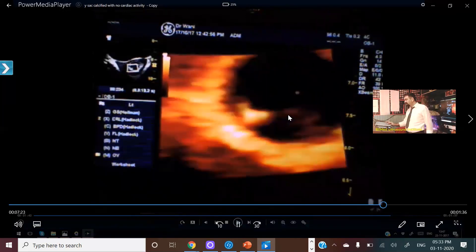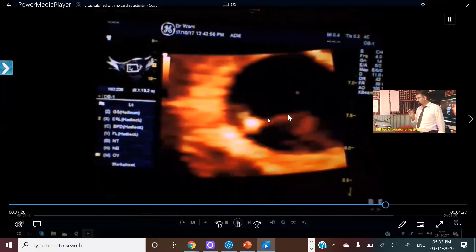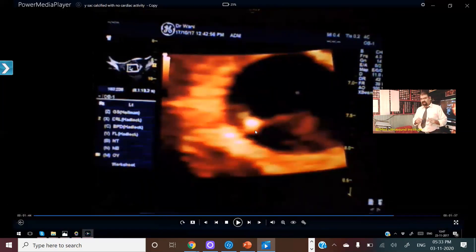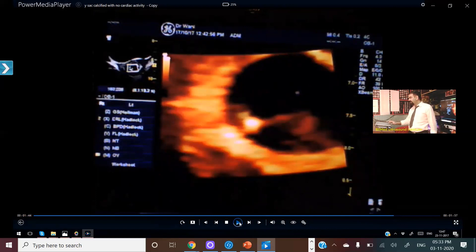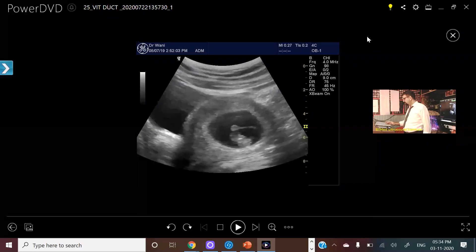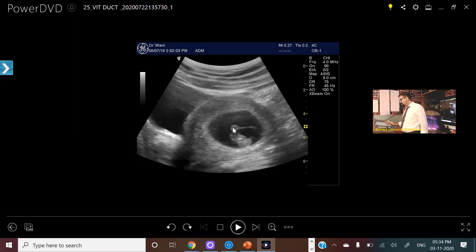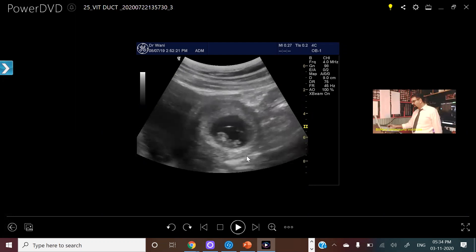The vitelline duct is coming over here, confirming that I am scanning the yolk sac. So the important points are: you should not see any calcification in the yolk sac, you should not be missing a yolk sac, you should not have a small yolk sac, and you should not have a very big yolk sac. This is the normal yolk sac over here. When I am measuring it, it is not less than two and not more than six millimeters, and I am not seeing calcification. This is a normal yolk sac.